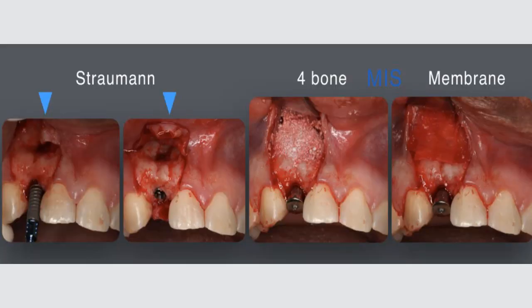In this case, particularly, unfortunately, we did not use the guide for placing the implant because we are missing one component to make the guide perfectly ready for using during the implant placement. But anyways, we use the burrs, we track it down, then the implant comes and we do the implant without guides. We would say this is a semi-guided process.